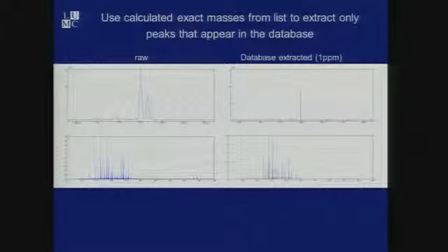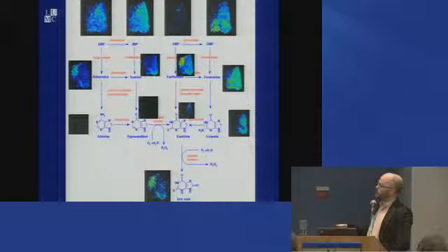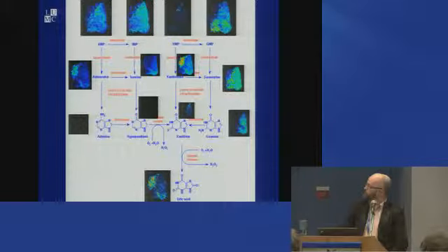But in this mass spectrum, every peak has also got its masses and pathway membership assigned to it. And so then it's very easy to plot these different types of metabolic pathways and try to put images there. And I'm sure we could do this in a much prettier manner if we spent more time on it, but you get the idea.